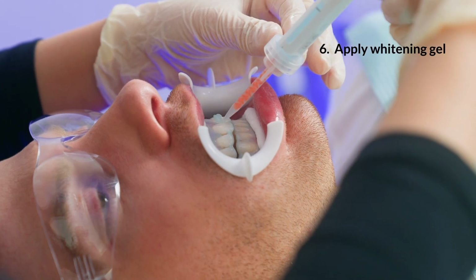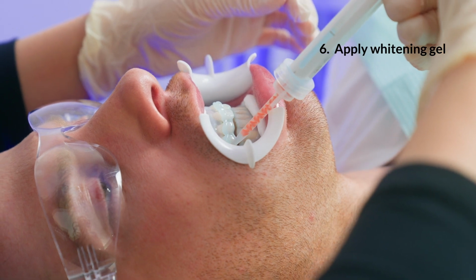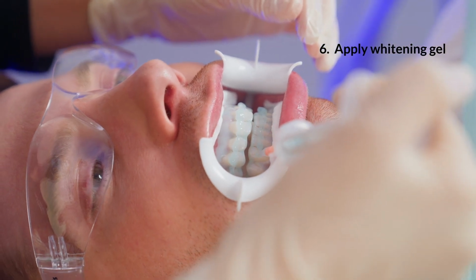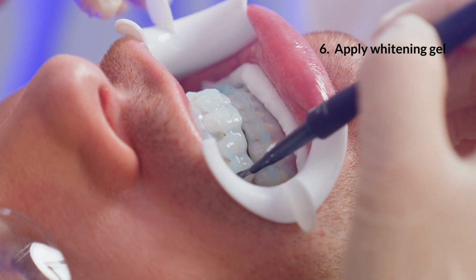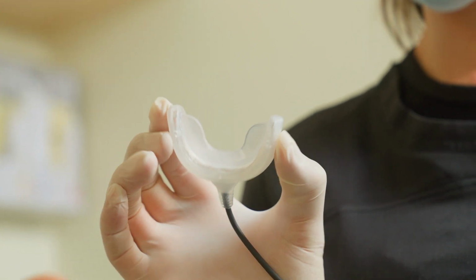Step 6. It's time to apply the whitening gel. Evenly coat each tooth surface, isolated for whitening with gel, 2 to 3 mm. Evenly brush the gel across the top and bottom of the teeth. Use bend a brush to evenly spread gel across upper and lower tooth surface.